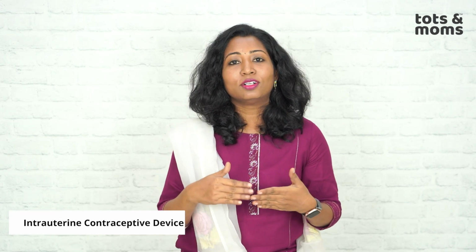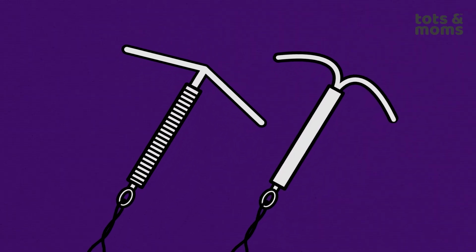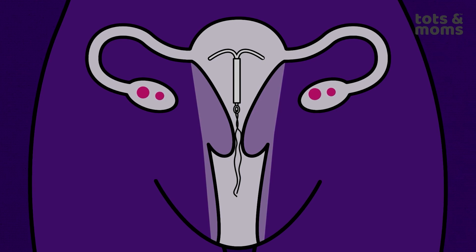My name is Kavita, and in today's video we are talking about IUD, intrauterine contraceptive device. They come in two variants. Both of them are T-shaped, made of soft, malleable plastic, and there is a small string attached to it. This T shape goes inside our uterus, gets locked there, and the string is left in the vagina.